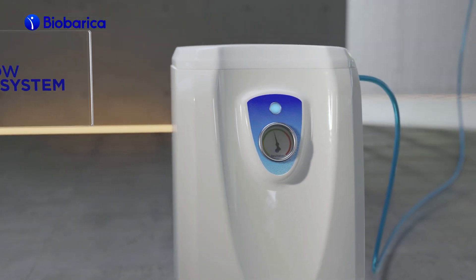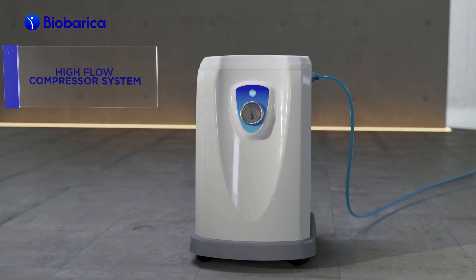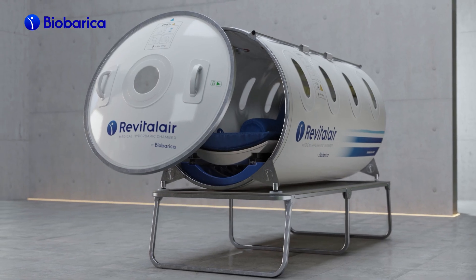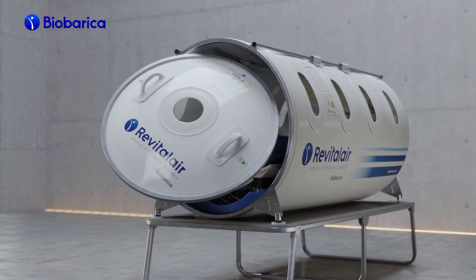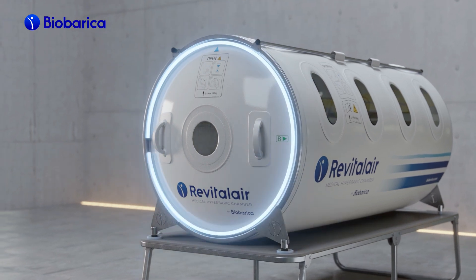The other component of the Revital Air 430 Hyperbaric Chamber is the high flow compressor system. The cabinet has two air compressors and its operation is very quiet. The zipperless closing system is easy and quick to use. The door closes hermetically with the air pressure, which is a unique feature in its design.